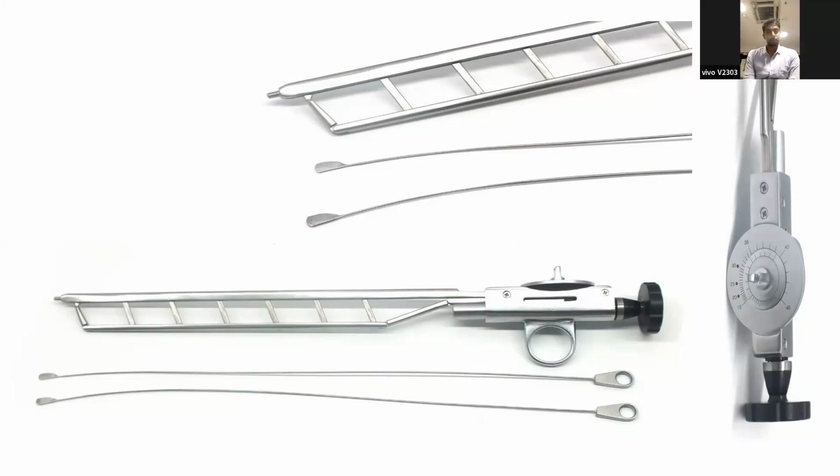So this particular instrument is used only as a prior urethral preparation for some procedure which is for a longer duration. So it is again a channel. I have not seen a curved Otis urethrotome, and I have not read about it either. But the channel is there. One central channel is there.